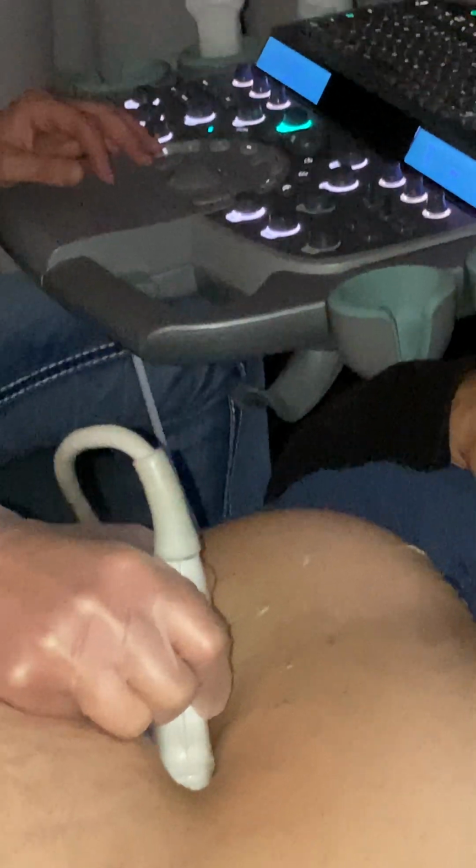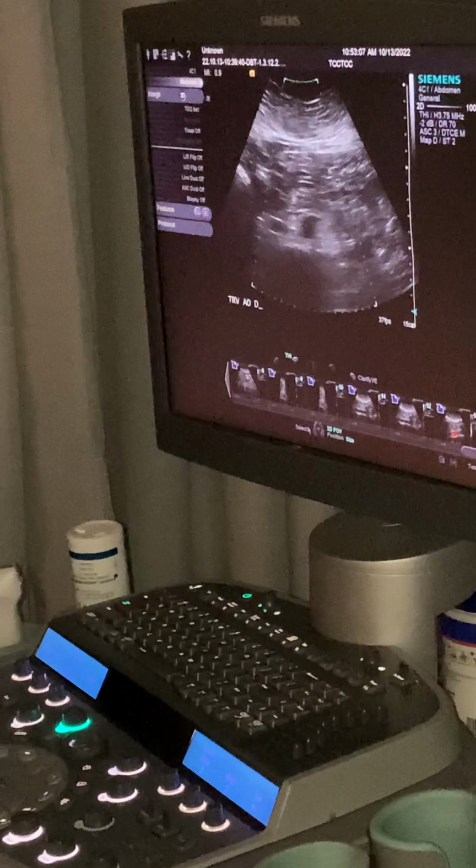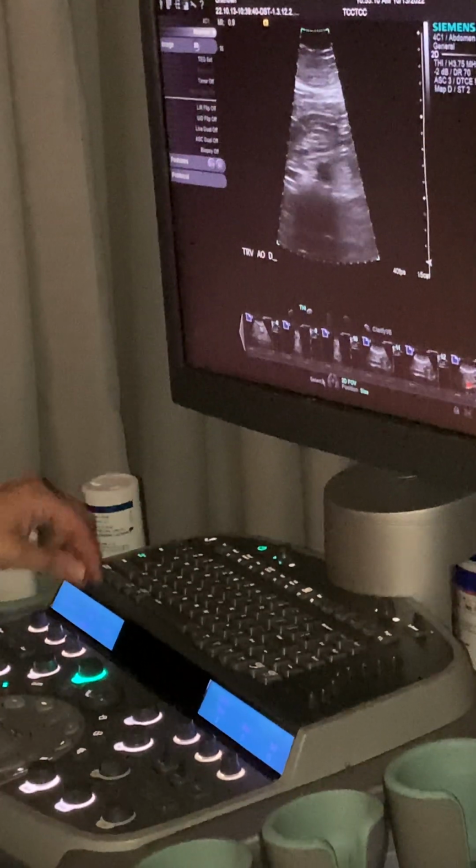Now what is my next step to image optimize this? Decrease the width. Decrease the width, you got it. So we're going to decrease that width. You could maybe go 2D down.